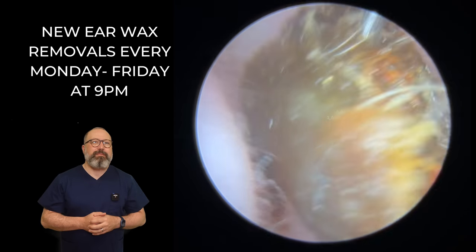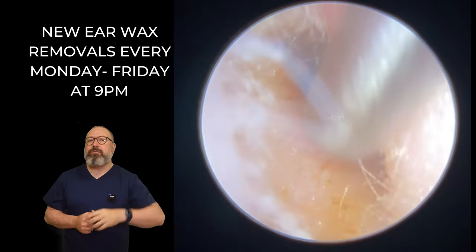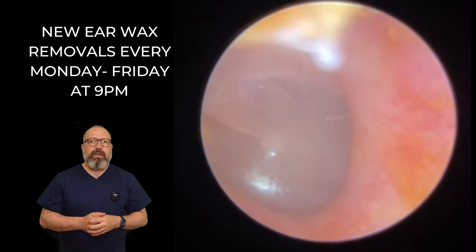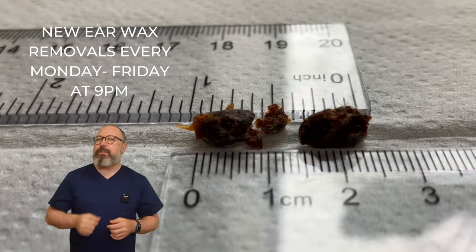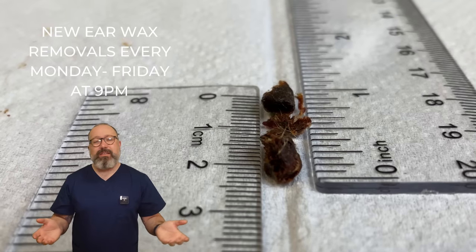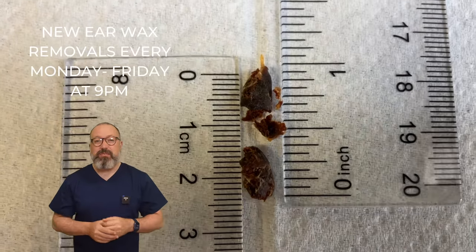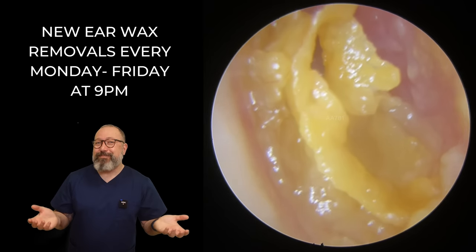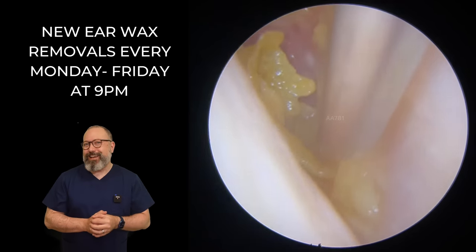There we go — out that plug comes. Lovely, very very nice. The reason I went for Rosen Inserter rather than St. Bart's hook is the gap is a little bit smaller at the top. Rosen Inserter is much easier to get beyond it. It's just tidying up the outside part of the ear canal here. Eardrum looking lovely and healthy. Now, the keen eye amongst you might have spotted that there was a little white bump just at the entrance to the canal in that bottom right-hand corner. You get those quite a lot inside the ear canals — it's nothing to worry about, it's just like a collection of skin, basically. Nothing untoward — nothing the patient needs to do anything about, just to keep an eye on it when they come through to the wax room. And I talked right the way over the ruler shot there — it was about two and a half centimetres.